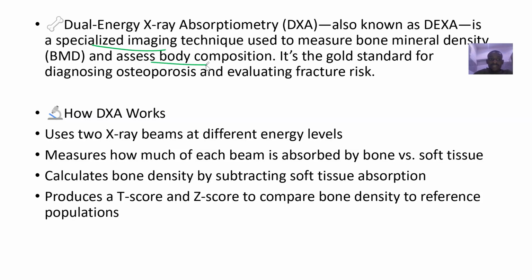It's the gold standard for diagnosing any condition that has to do with bone fracture, especially osteoporosis. You can also have osteopenia, rickets, osteomalacia. There are so many, but mostly osteoporosis. Okay, so how does it work?